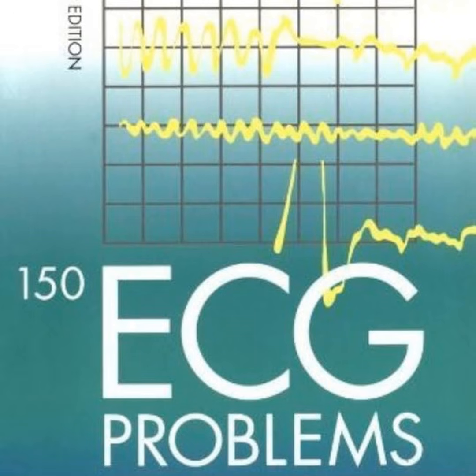Got it. Patient B is a man with a known history of an anterior myocardial infarction. He is presenting with a broad complex tachycardia at 250 beats per minute, and the QRS duration is a massive 200 milliseconds with this ugly, just bizarre morphology.